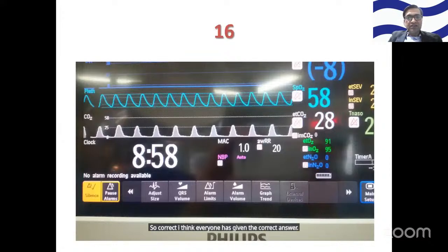Okay, what could be this? So I'll tell you some clinical scenario. It's a saturation of 58. This is a pediatric patient of tetralogy of Fallot. So that's why the saturation is low, and you get this kind of inverted U, not the typical four-phase, it's sort of an inverted U kind of waveform. What could be the possibility? And we are giving 100% oxygen.